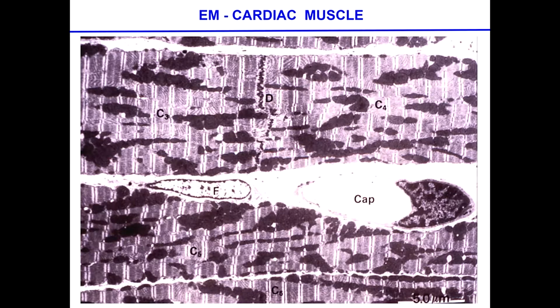As we looked at during the lecture, the structures that you find in the vertical portion are not the same as you find in the horizontal portions. In the horizontal portions, primarily what you find is gap junctions. In the vertical portion, you find the fascia adherens and the desmosome, which are the tightest kind of unions between them. Questions?